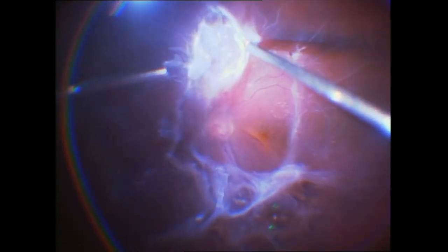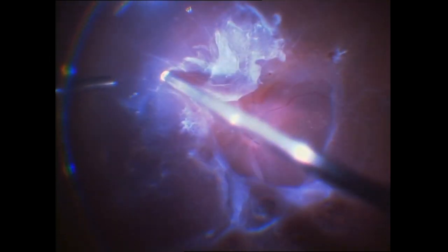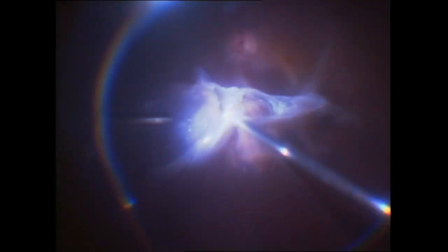To start with, the cutter is used unimanually to segment all of the membrane. Once the segmentation is complete, it's then used to safely remove as much membrane as possible without causing an iatrogenic break.